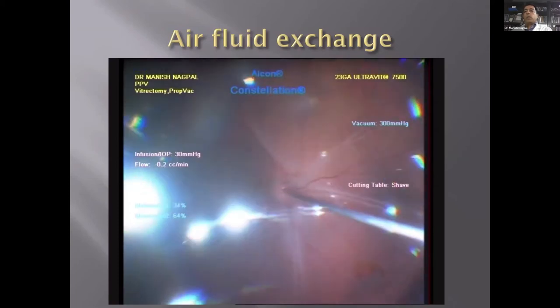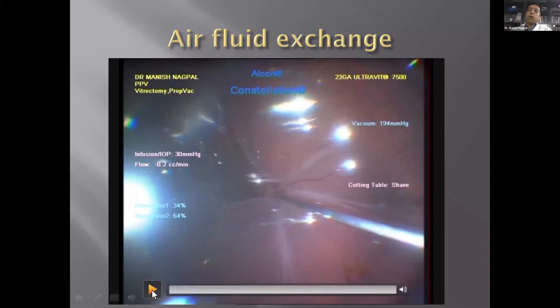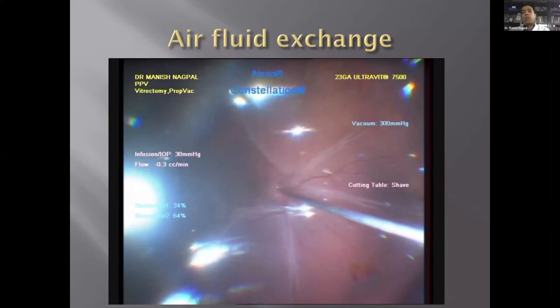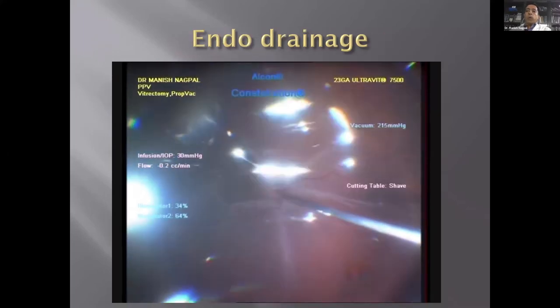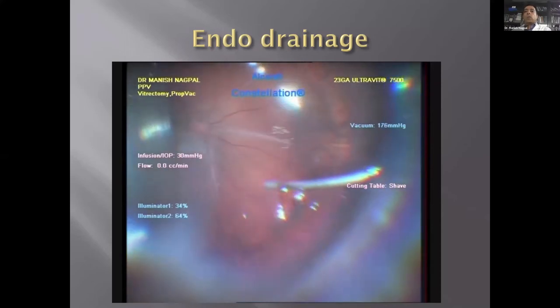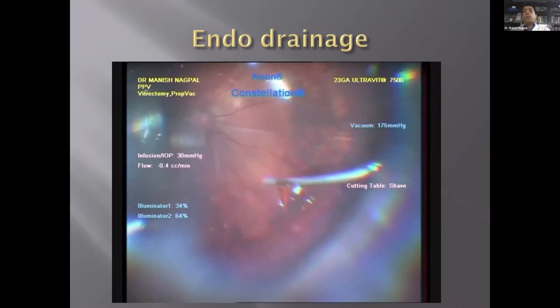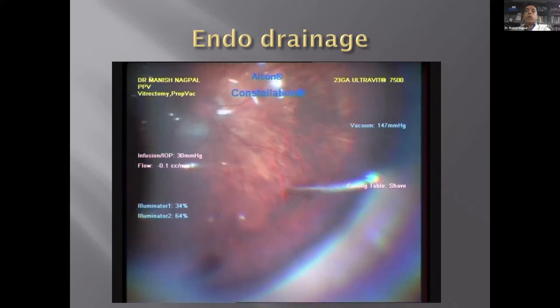The next step is air-fluid exchange — once vitreous is gone, switch to air, then go to the break or create a retinotomy based on ergonomics of drainage. Here we aspirate from the break itself and the retina gradually flattens — this is endodrainage. In this case, we used the pre-existing break to drain.